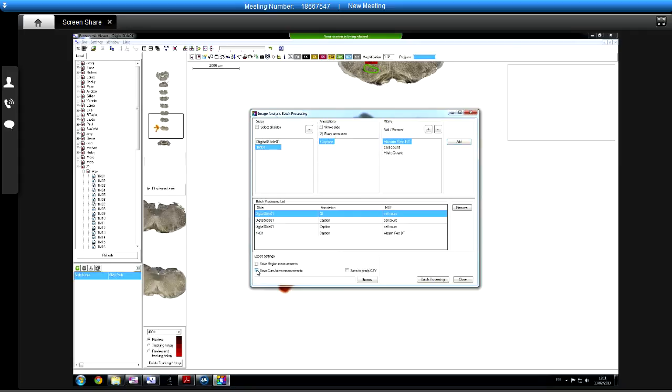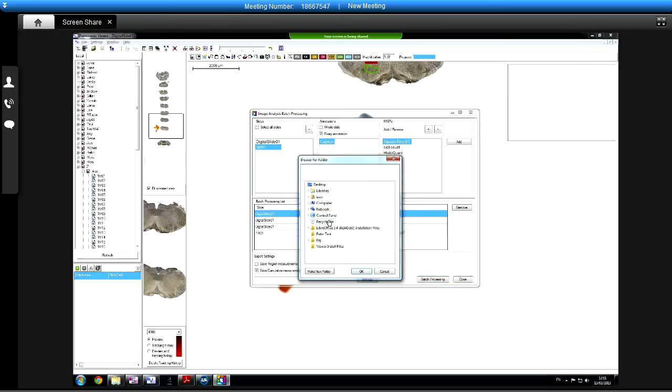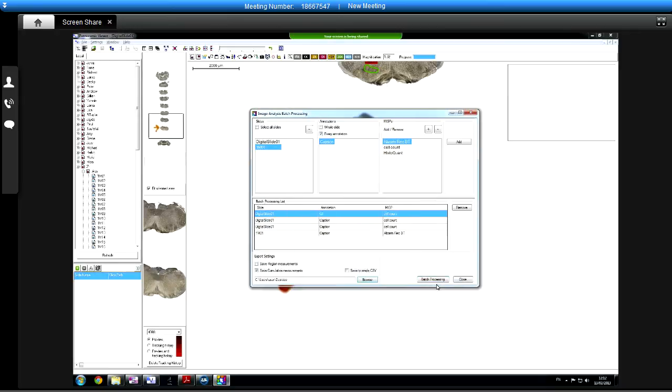And then when I click batch processing there, it will just sit there and chug its way through all those annotations and all those slides. So as I say, I think in the real world you're likely to mark up about 10 slides, whatever, aren't you? And then leave that to go. What you can do is, there's nothing to stop you while that's running. Please specify destination for it. Just put it on the desktop now. Yeah, you can flip back to here and you can still play with slides and leave that running in the background, etc.